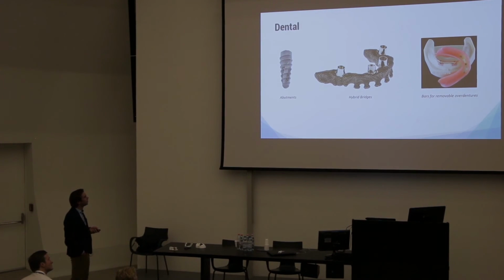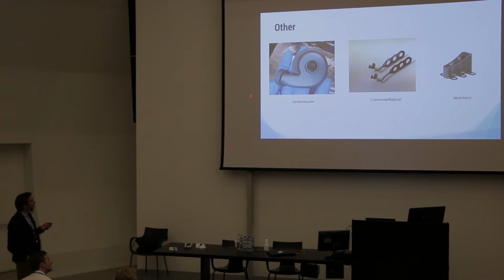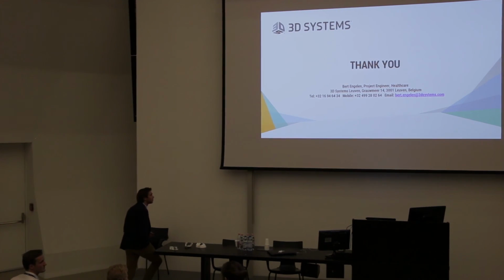And then some other applications that we work on is here a cardiovascular pump cover for a heart pump, some hooks for craniomaxillofacial surgery, and a veterinary implant which is used as a wedge for bone building in dogs, actually. So I think that was mainly my presentation.